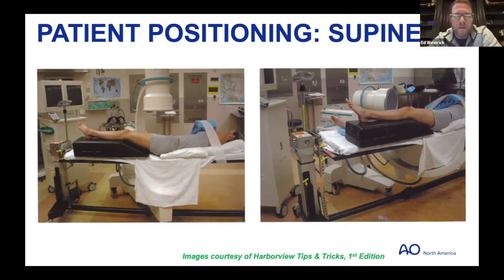Yeah, we call it the butt cheek test, right? If you put your hand on the edge of the bed, their butt cheek should sit on top of your hand. Otherwise, they're not over lateral far enough. And the other, it's a Beverly Hills thing, I think. No, yeah. You don't want the other extremity moving as well, and you want to do everything you can to prevent the patient from sliding towards the contralateral side during the case.